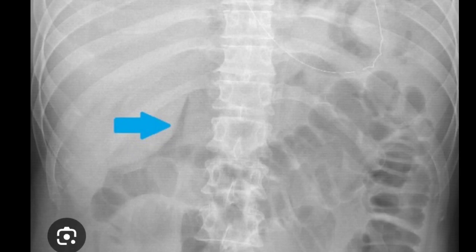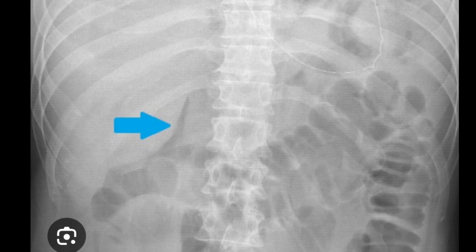Pneumoperitoneum may be caused by perforations due to peptic ulcers, malignant neoplasms, obstruction, peritoneal dialysis, surgeries, pneumomediastinum, or pneumothorax, and sometimes there may be no reason. The dodge cap sign, when appreciated on the abdominal radiograph, is a confirmatory sign for pneumoperitoneum.